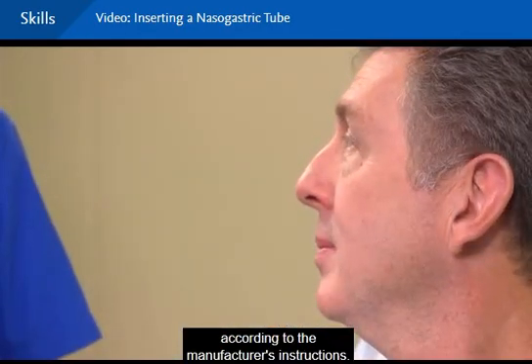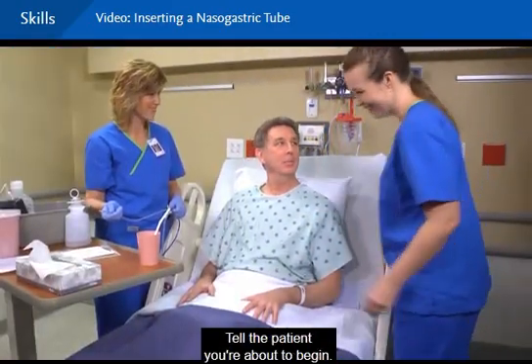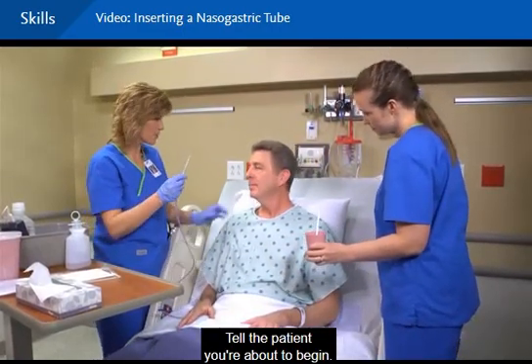Tina's going to come in and help us with the procedure right now. Okay. Tell the patient you're about to begin. She's going to be in charge of making sure that you drink the water whenever we need you to as we're inserting the tube, okay? Okay. We're going to get started.